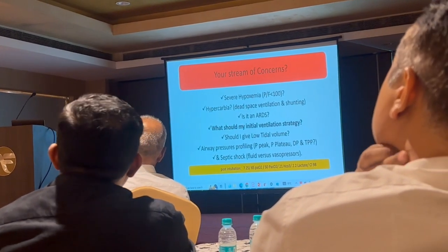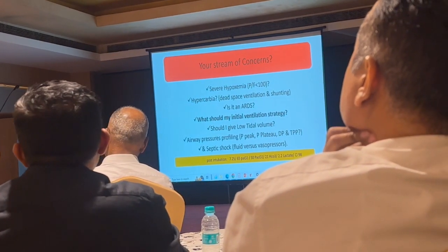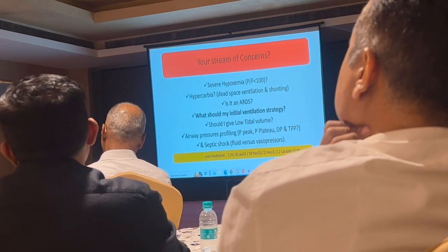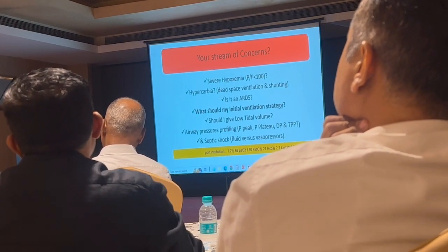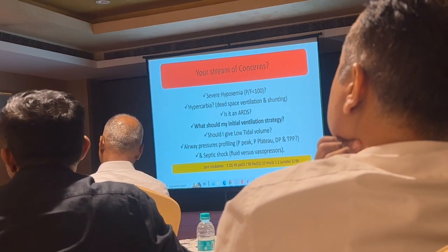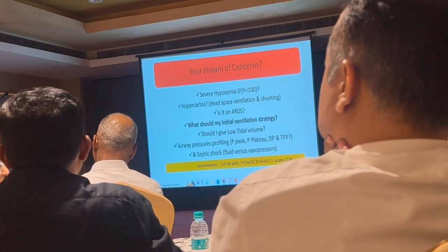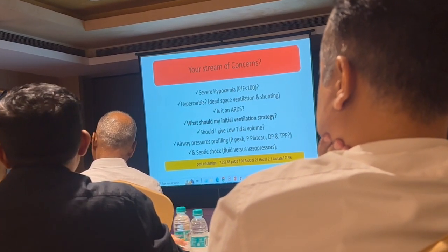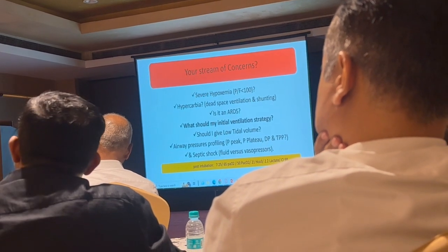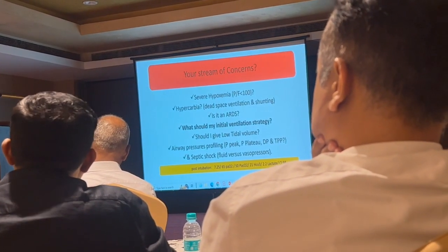And obviously, we have been talking about the airway profiling, which we have seen and listened to in the last two sessions, especially the transpulmonary pressures. But before TPP comes, which is very advanced, the basic airway pressure profiling, which means your peak airway pressures and plateau airway pressures, have to be seen, right? And obviously, septic shock is a big concern because when you're using PEEP and volume, you have to see that it should not be hampering the patient's hemodynamics, right? So these are the basic concerns, right?